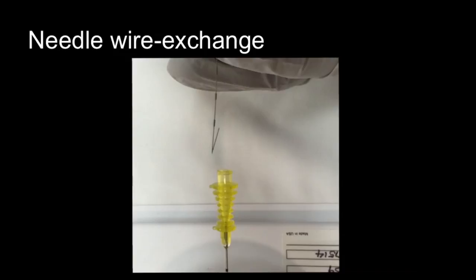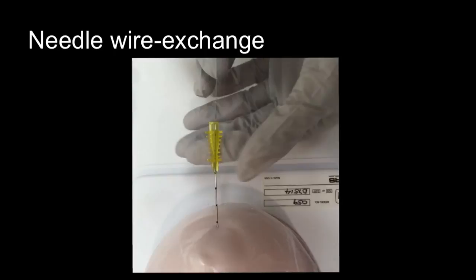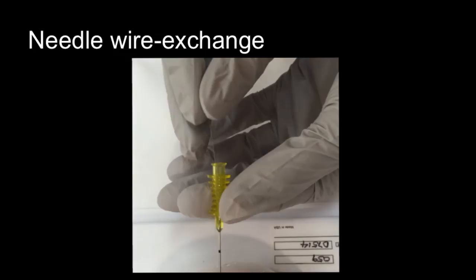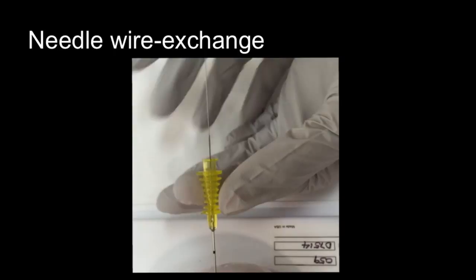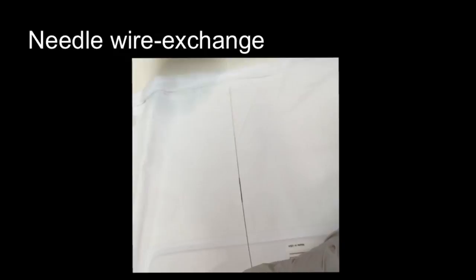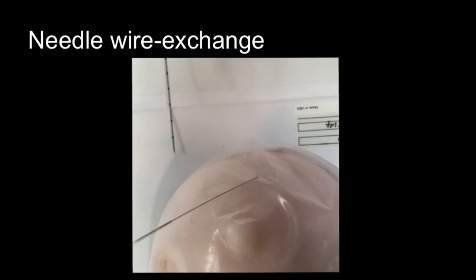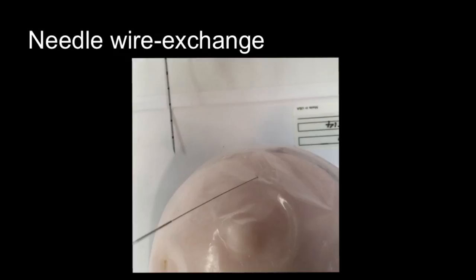If using a non-repositionable wire, once appropriate needle positioning has been confirmed on the orthogonal view, a needle wire exchange is performed. The wire is advanced into the needle while the needle is steadily held in place. How far you advance depends on the wire markings — advance to the first black marking to confirm the wire is securely in place. Hold the wire firmly while pulling the needle out of the breast. Once out, remove the needle entirely from around the wire. The technologist then takes another image to confirm accurate positioning of the target in relation to the wire.